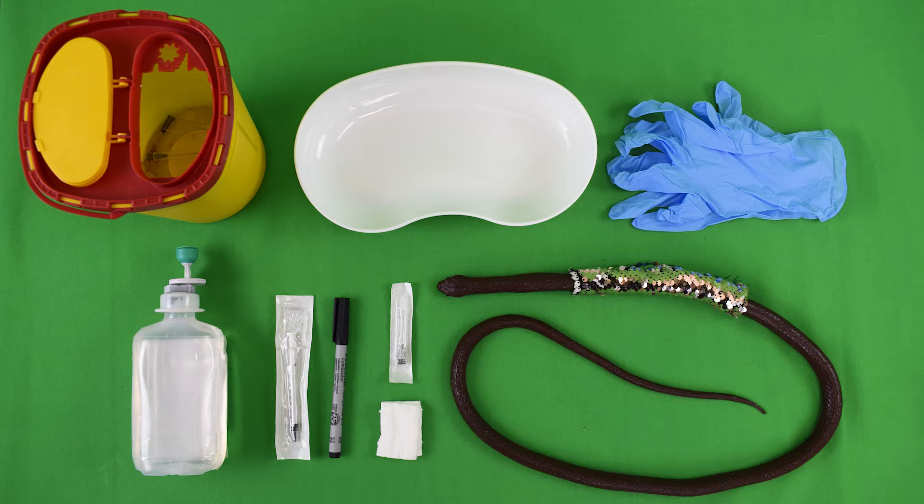Needed for this skill lab exercise are a disposal container, a kidney dish, disposable gloves, the injection solution, a 1 milliliter syringe, a water-resistant marker, a grey or black cannula, gauze swabs, and the simulator.